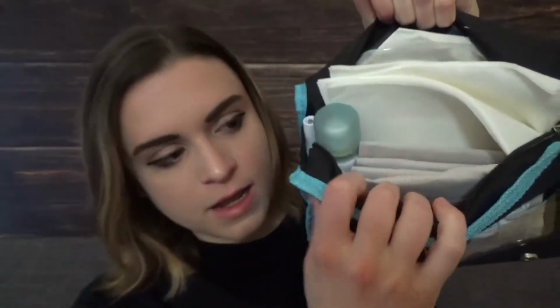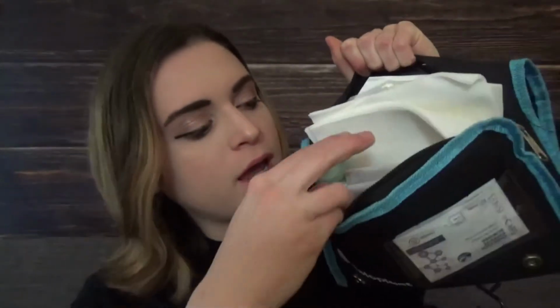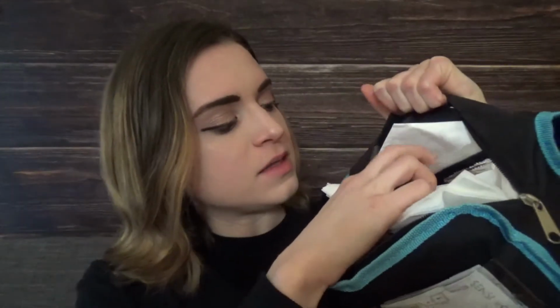I'm going to show you some of the other things that I like to bring in my travel bag for my trips with an ostomy. This is the inside. It's got adhesive remover spray. It's obviously got bags. It has some wound dressing since I still have an open wound. It has things like Aquacel and Tegaderm in here. I have barrier strips that help extend the perimeter of my wafer just to give me some extra protection.